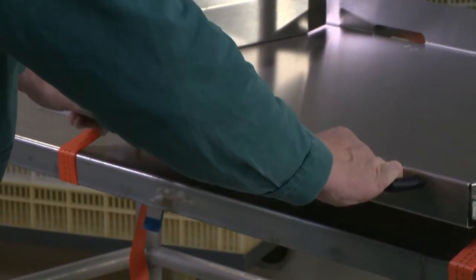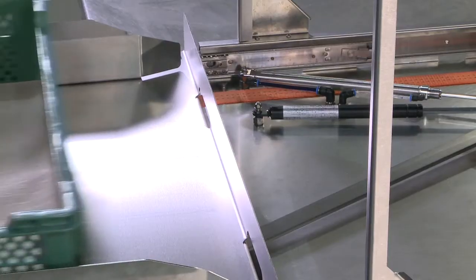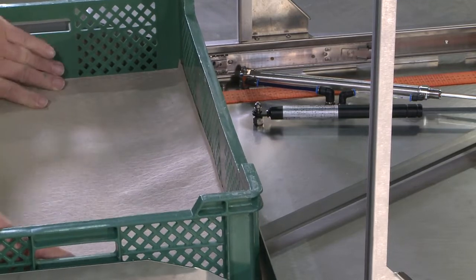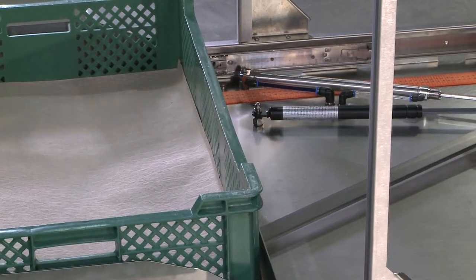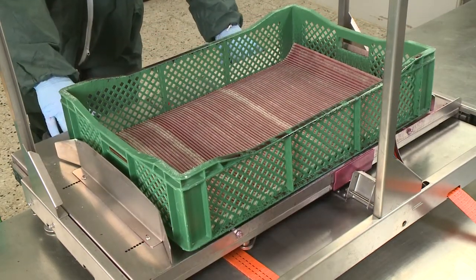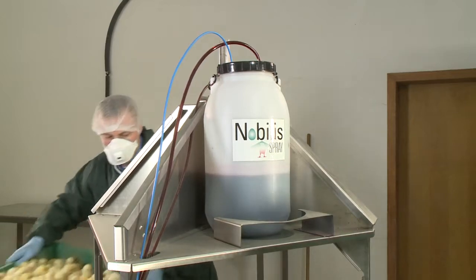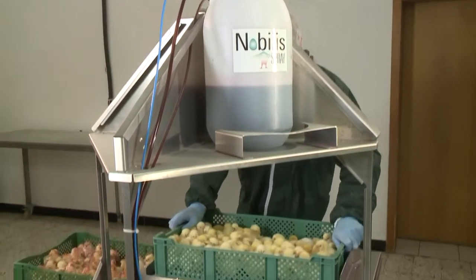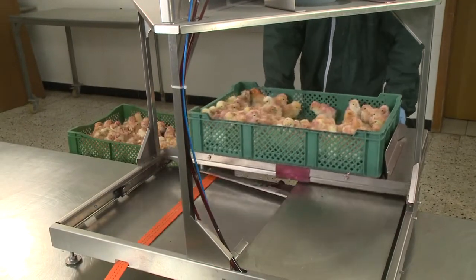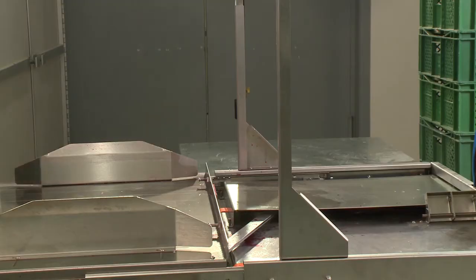The machine's function is based on a manual pneumatic system. By holding both handles, the operator pulls the drawer out of the device until it stops. In this step, the pump cylinder is filled with vaccine. Then the drawer is pushed gently inwards into the device until it stops. During this process, the selected volume of vaccine passes the spray nozzle and pours down onto the day-old chicks. By pulling the drawer out again, the piston is preloaded to release another dose of vaccine.